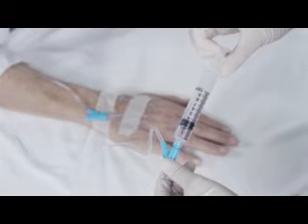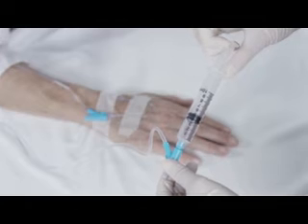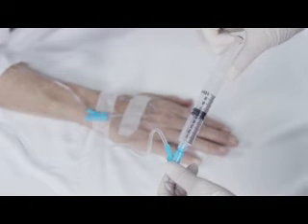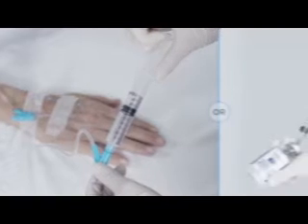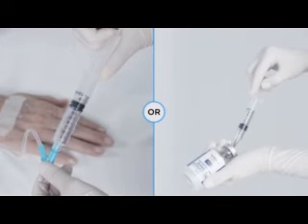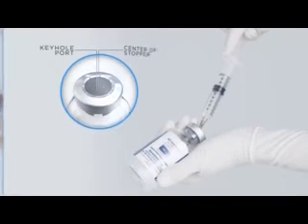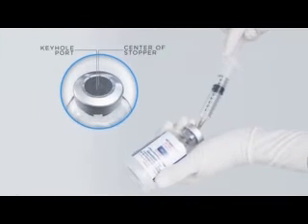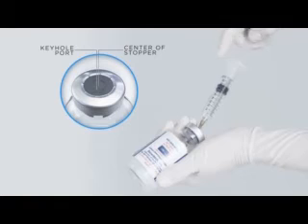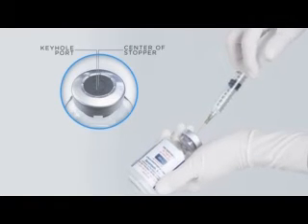Using a syringe and needle, remove the dose from the Y-side injection port on the infusion line after the infusion set is primed. Or, remove the dose from the vial before the vial is attached to the infusion set. Be sure to insert the needle into the keyhole port of the vial top, away from the puncture site made by the transfer device. Do not prime the syringe with air.